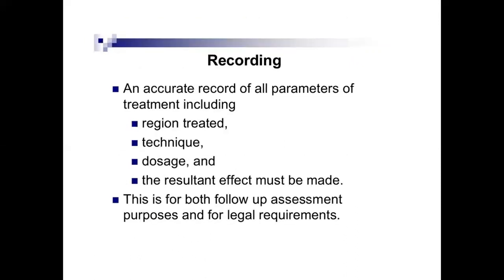Next, we have the recording. We keep an accurate record of all the parameters of treatment, including the region treated, the technique used, the dosage, the time, and the resultant effect on the muscle. This is both for follow-up assessment and for legal requirement.